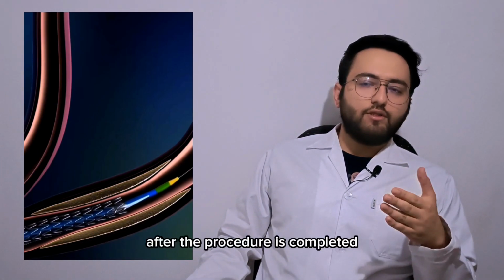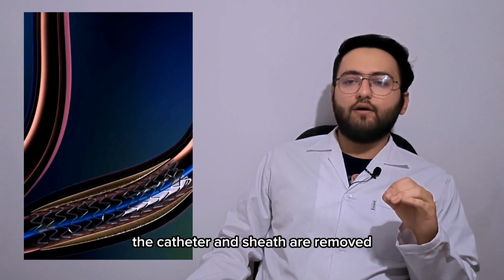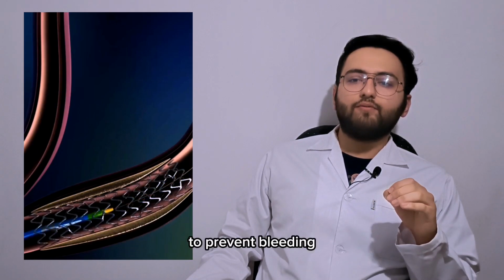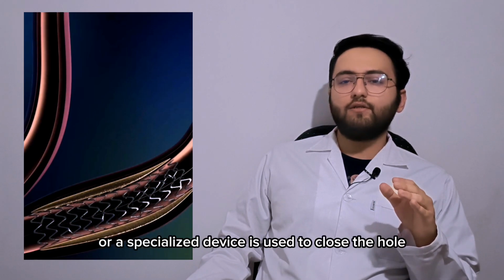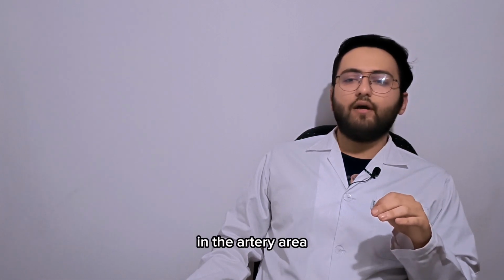After the procedure is completed, the catheter and sheath are removed. Pressure is held at the site of the puncture to prevent bleeding, or a specialized device is used to close the hole in the artery area and to aid in healing.